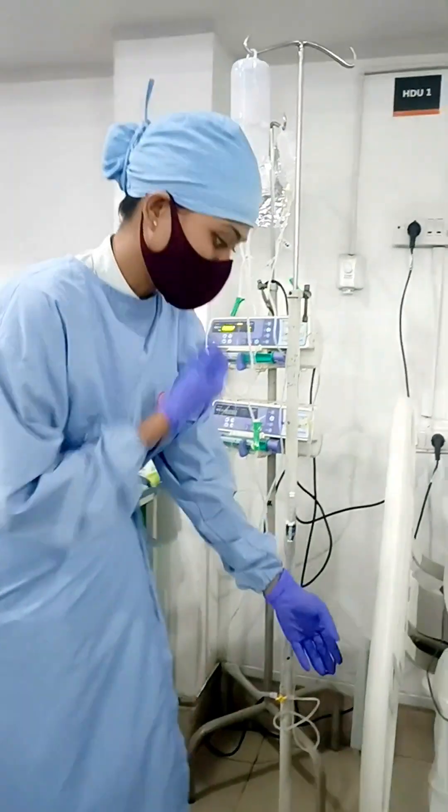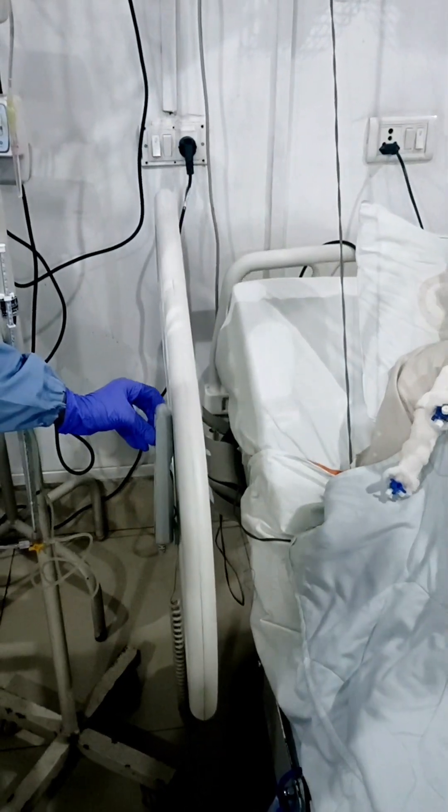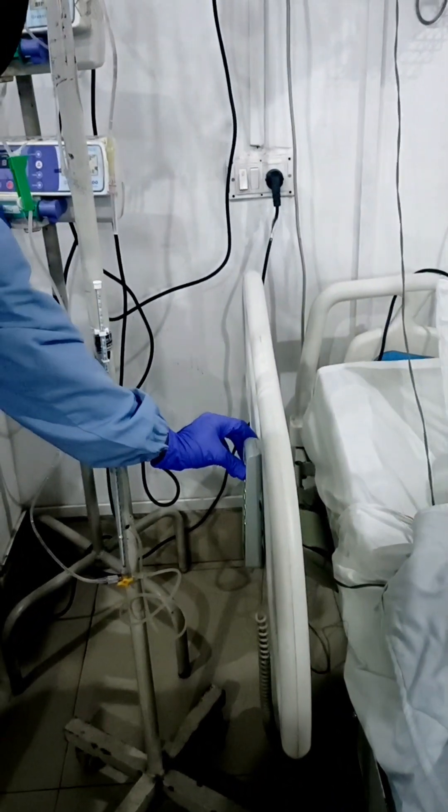First, I am going to give a flat position to the patient. Make sure that the central venous manometer and the patient are both in a flat position.